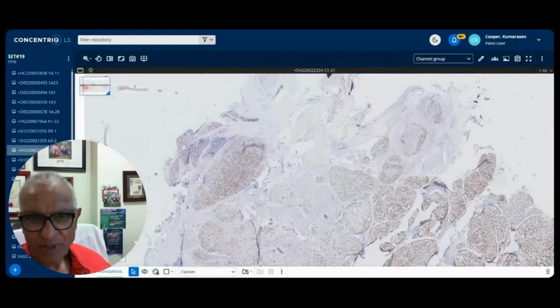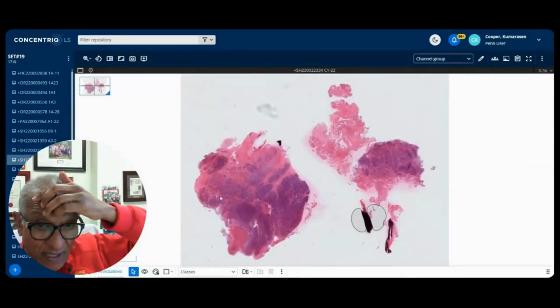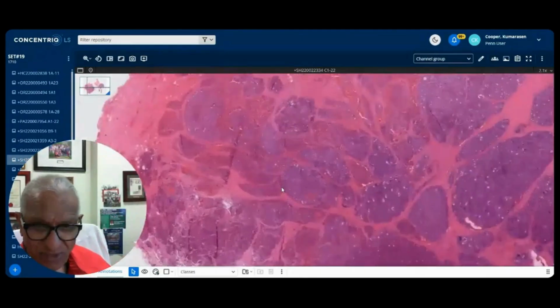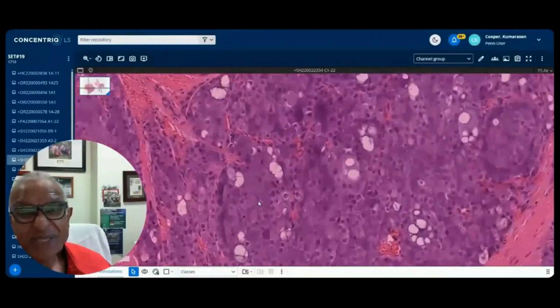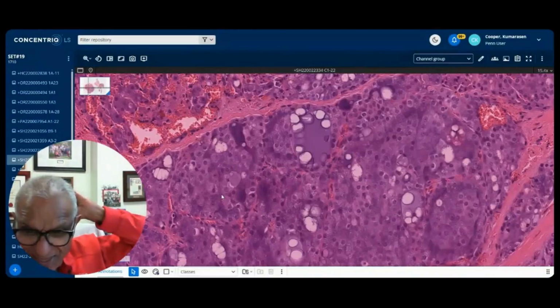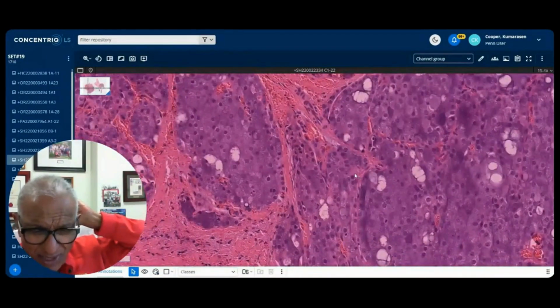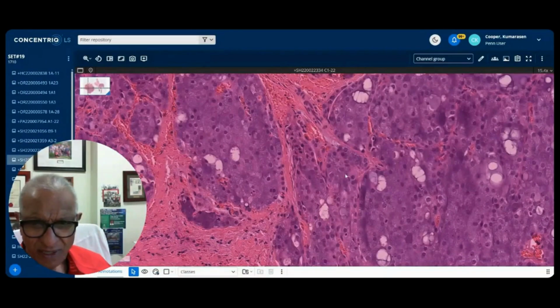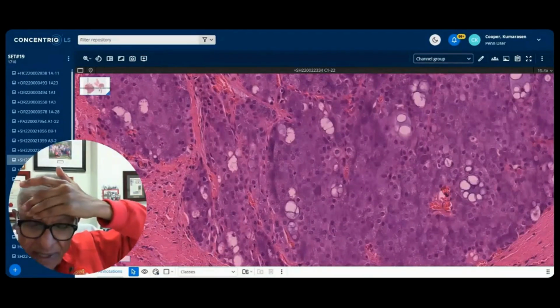The other discussion I was going to have was the secretory carcinoma, and the reason I was talking about that earlier, just to show you these vacuoles and some of them having that eosinophilic secretion. But Tom will tell you that the cytoplasm is wrong for secretory carcinoma, I suppose. But as you know, those stain up with the breast markers, the usual mammaglobin, GATA3, and those are negative in acinic cell carcinoma.